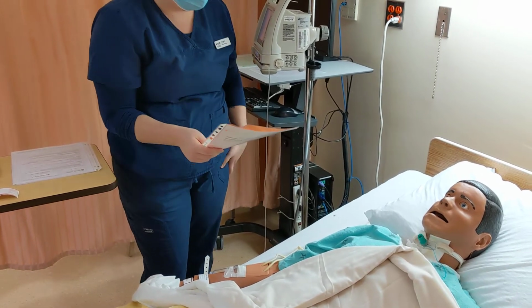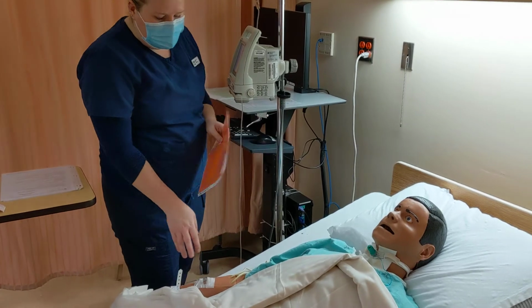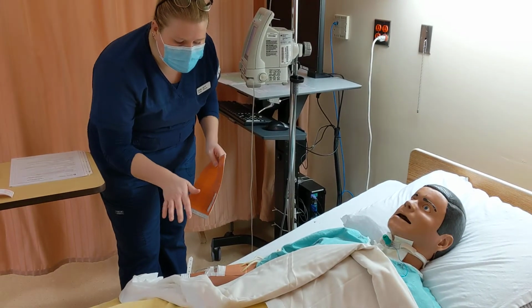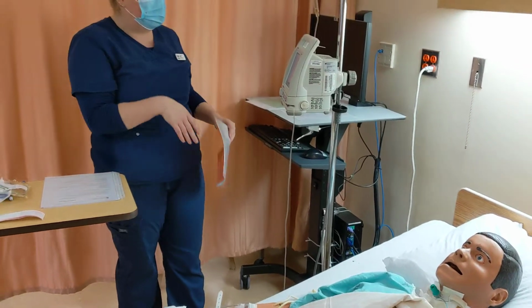After I've done that check and we've gotten all the information correct, I'm going to check the IV site. So palpating for any phlebitis, extravasation, everything looks good, no leakage, no pain, everything's open properly, and the line is infusing.